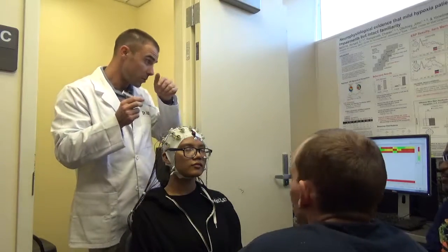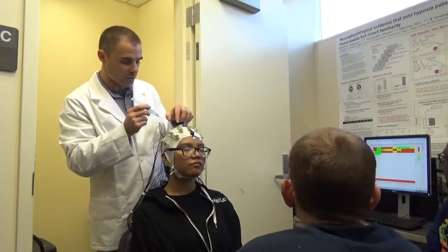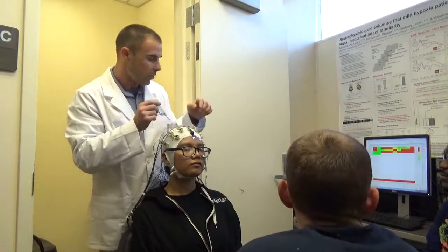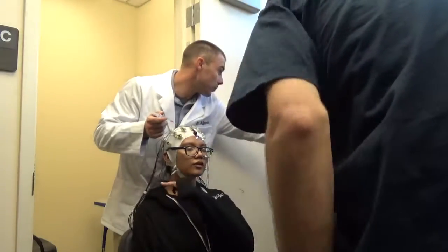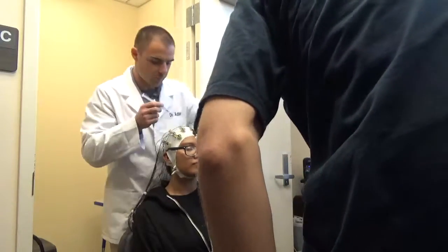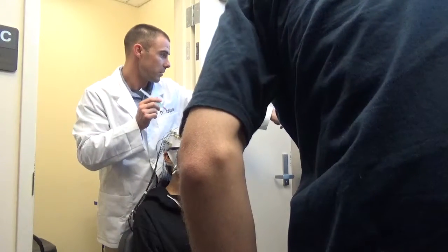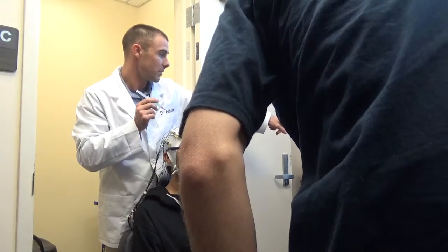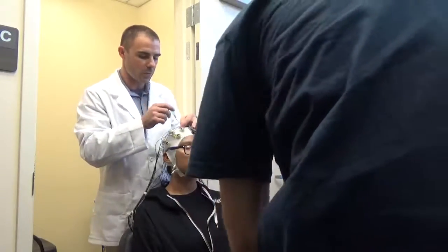Okay? So what you want to do is find out which one. In this case, it's electrode 30. Which one is 30? F2. So that's going to be this one. So I can find out where F2 is on there. Alright. Show me the box. Okay, so see that bottom right red box? That's what I'm going to be working right here.